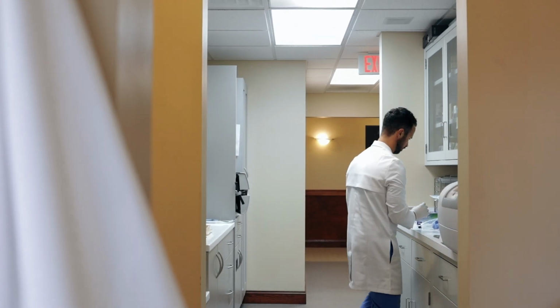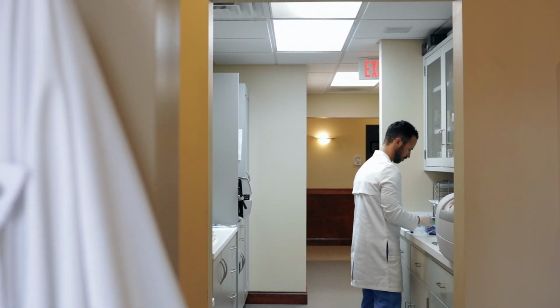I would encourage you to give the radiographs a good look before you even walk into the operatory. That way, more often than not, you have a really good idea as to what's going on with your patient before you even greet them. Is the tooth previously treated? Are there any large carious lesions? Is there an apical lesion? Any sign of resorption into or near the pulp? Did you recently place any restorations in the patient's mouth? This should only take you 5 or 10 seconds.